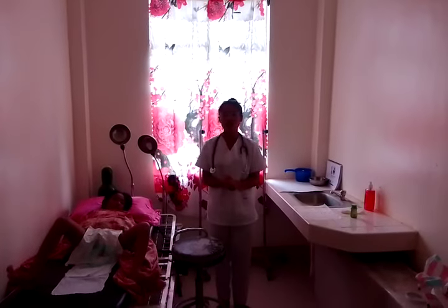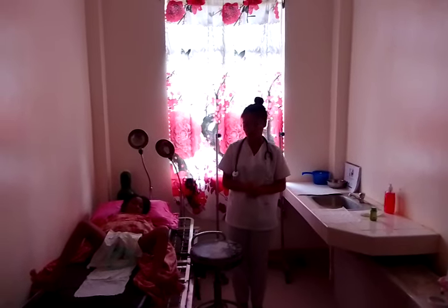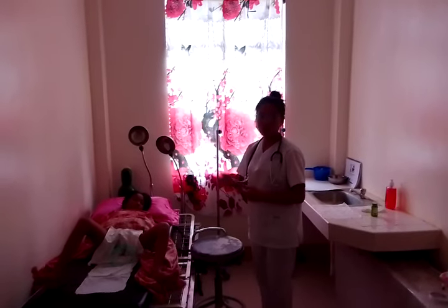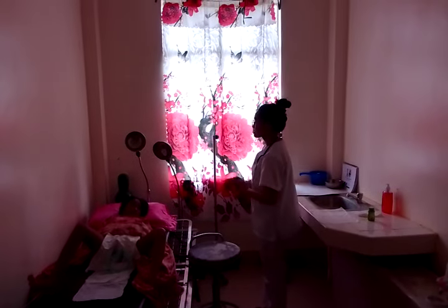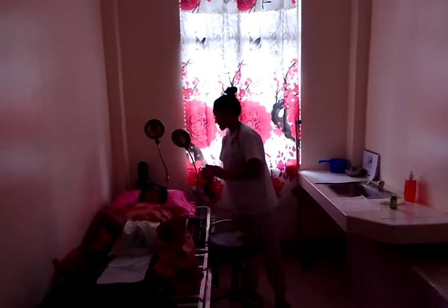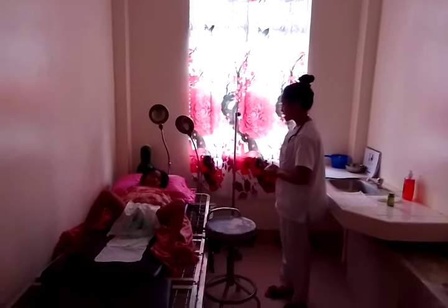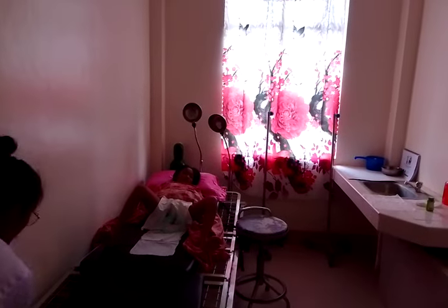We need to ensure the signaling device is within reach and the bed is in a low position. Ma'am, if ever you need anything, just click the bell on your right side so we can assist you right away. I will also adjust your bed to a comfortable and low position.